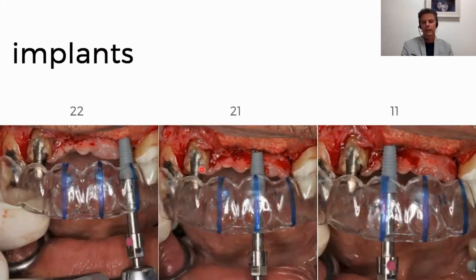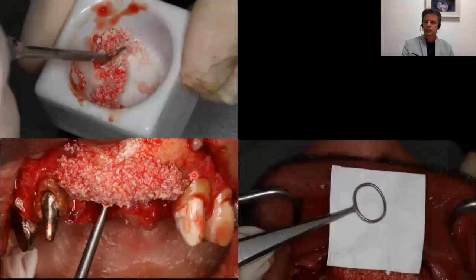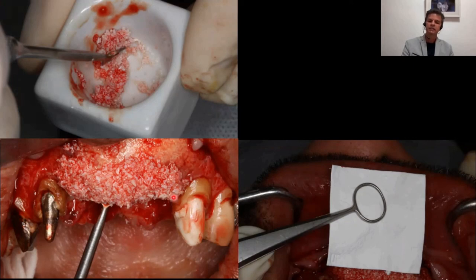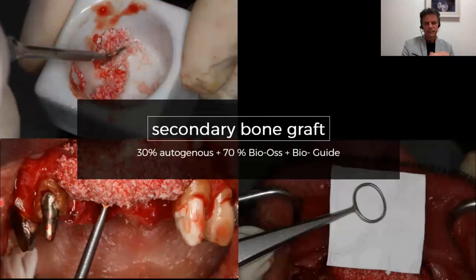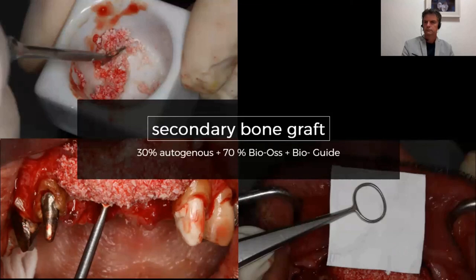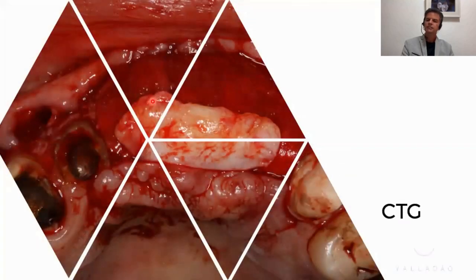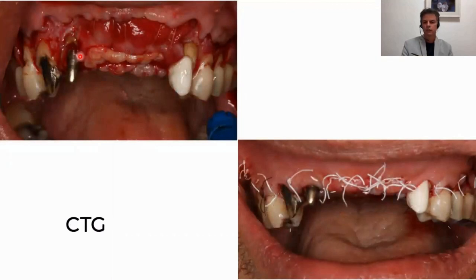The implants were installed in a conventional way with a surgical guide. A secondary graft was used, with 30% autogenous bone mixed with Bio-Oss. As demonstrated by Urban, this graft protects the newly formed bone, especially in the crest region. The graft was covered with a Bio-Gide membrane and immobilized with resorbable sutures. A connective tissue graft removed from the palate was positioned at the site, held in place with internal resorbable sutures, to increase tissue thickness and boost the gingival biotype of this patient.